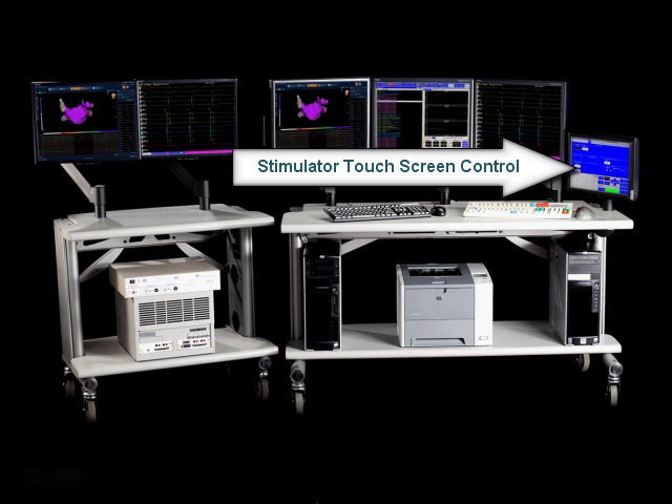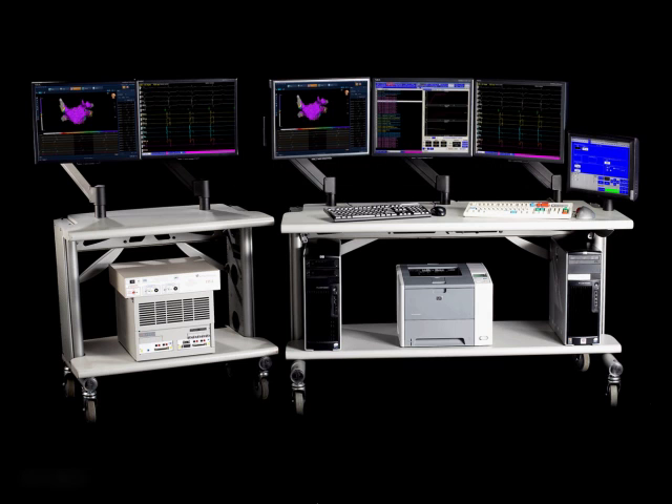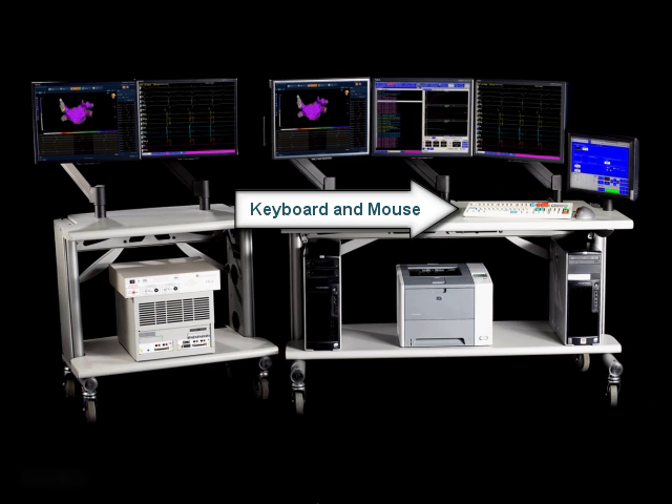The integrated stimulator allows for pacing during the EP study, and the touch screen control allows the user to control the stimulator during the study. The keyboard and mouse are the human interface devices that allow the user to input data into the EP Workmate Recording System.